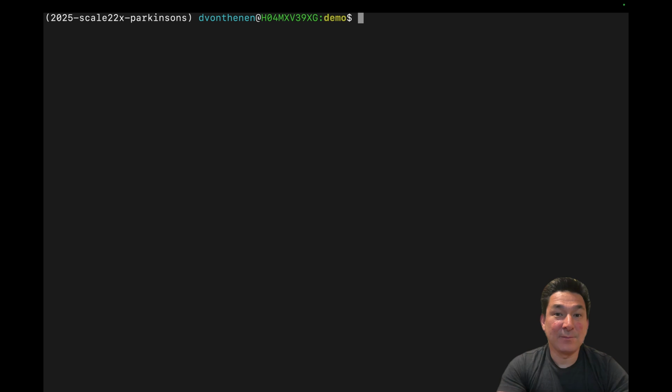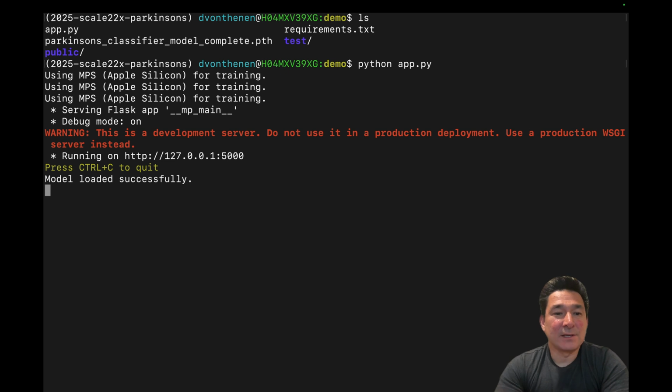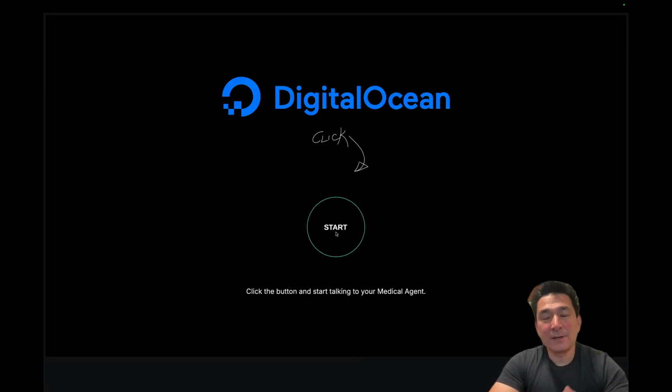Finally, if you go into the demo folder, you can see that we have the Parkinson's classifier model there along with our test folder. And this folder creates a voice assistant where you can actually query the model using speech to text and text to speech, where you can query the model about particular test results for patients. So let's go ahead and try to run this demo. This is going to stand up a web page that you can navigate to. And if we click start, we can talk into it, and we can get more information about Parkinson's disease. Let's try it.